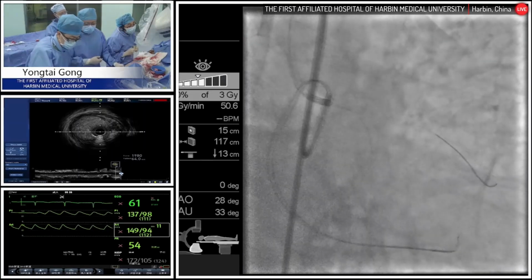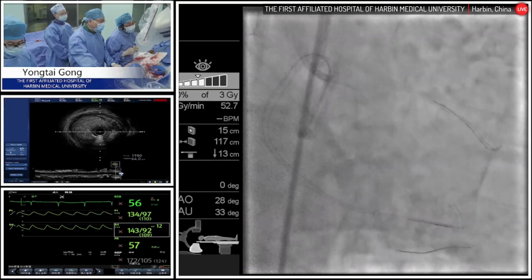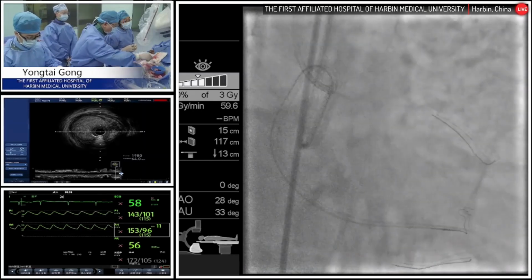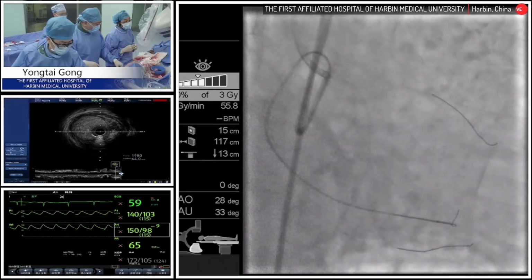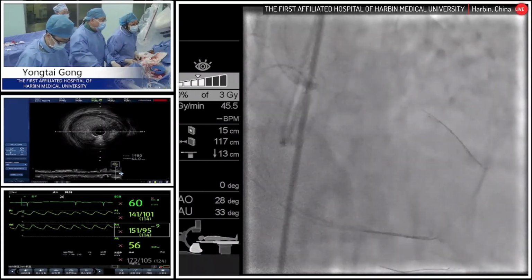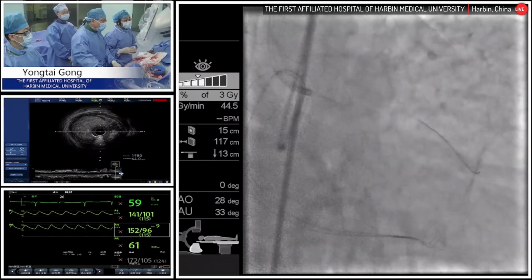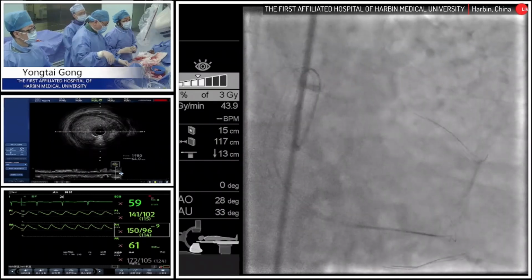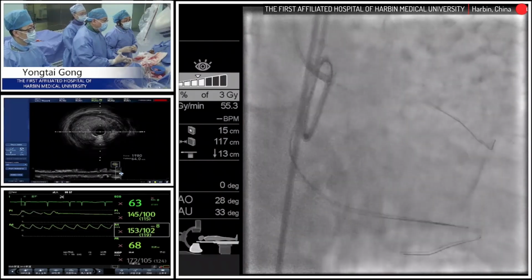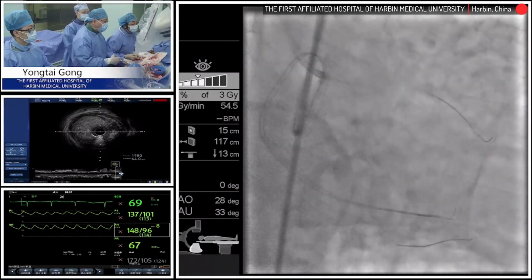Several things can be found, for example, the side branch failed to engage the CTO because the occlusion of the side branch has a relatively blunt tip. There is no entry point. This kind of phenomenon is caused by, how to say, the blood flow from the retrograde, which caused the plaque composition and also the development going up to the bifurcation site. Also, the insertion of a guide wire into the side branch, which is difficult, can act as a marker for the side branch origin. We can also try balloon inflation in the side branch, or a non-inflated balloon, to block the wire. And we can try a dual lumen microcatheter from the antegrade in this case. However, it's not a guarantee for the right entry point puncture.